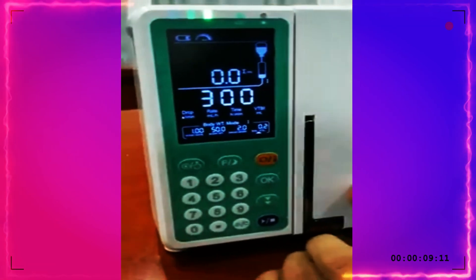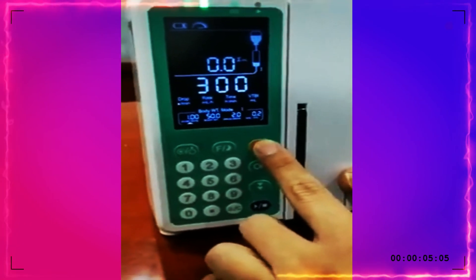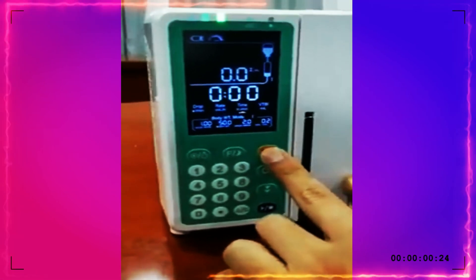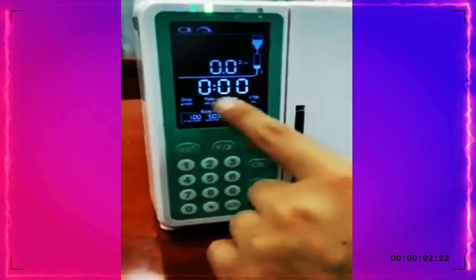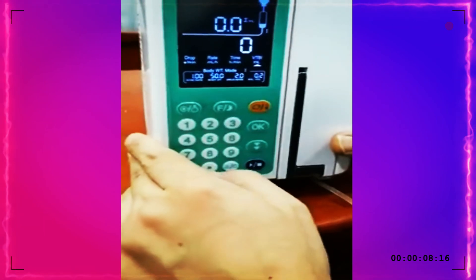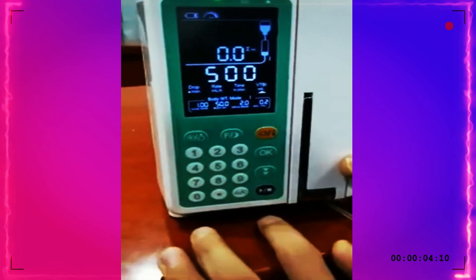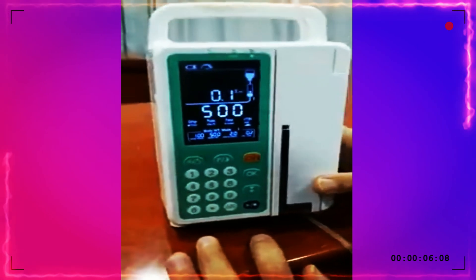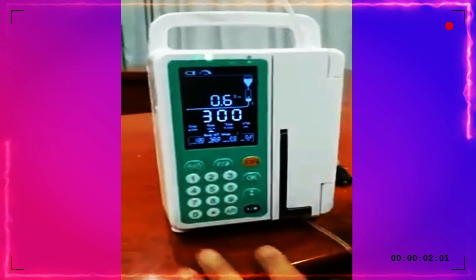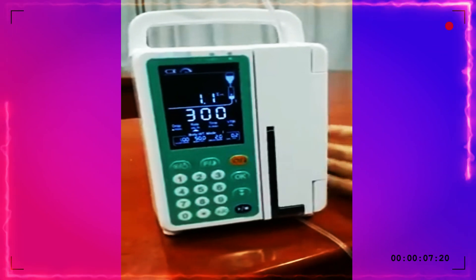Press OK to confirm. Now the rate is already automatically set to 300. Then, for example, set the VTBI — the volume to be infused — to 500. Then press start. This is the body weight mode, and here you can see the drug already infused to the patient displayed on screen.